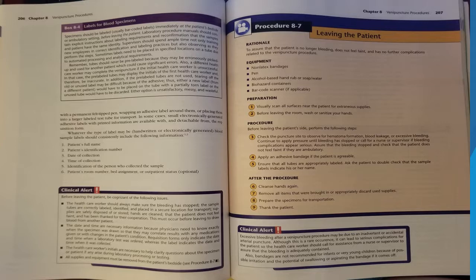Clinical alert. Excessive bleeding after a venipuncture procedure may be due to an inadvertent or accidental arterial puncture. Although this is a rare occurrence, it can lead to serious complications for the patient. So the healthcare worker should call for assistance from a nurse or supervisor to assure that the bleeding is adequately contained. Also, bandages are not recommended for infants or very young children because of possible irritation and the potential of swallowing or aspirating the bandage if it comes off.